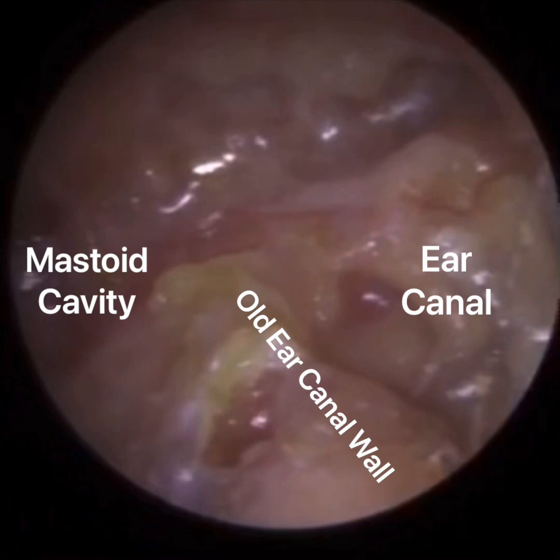The benefit of that is that the ENT surgeon can be really sure that there's no dead skin left behind, because you've opened up the canal completely and you can see everything. So there's a really minimal chance of a recurrence of a cholesteatoma or mastoiditis. However, when you've got a big open mastoid cavity, skin doesn't migrate as well. So that skin, as you can see, is just layering, coating the canal wall. So an open mastoidectomy needs regular cleaning. This skin does need to be cleaned as it's not shedding naturally, because that skin can get infected. And obviously, patients are going to be really careful of avoiding water in the ear.